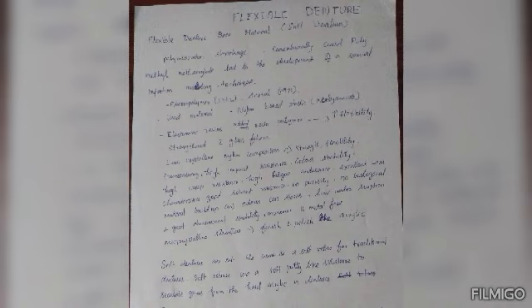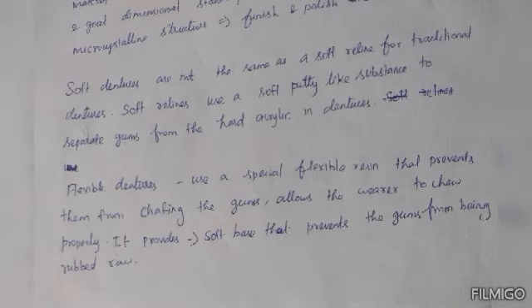So the semi-crystalline nylon composition gives strength, flexibility, transparency, high impact resistance, color stability, high creep resistance, high fatigue endurance, excellent wear characteristics, good solvent resistance, no porosity, no biological material buildup or odors or stains. So low water sorption and good dimensional stability, monomer and metal free microcrystalline structure. It gives finish and polish like acrylic. So these are all about flexible denture based material.